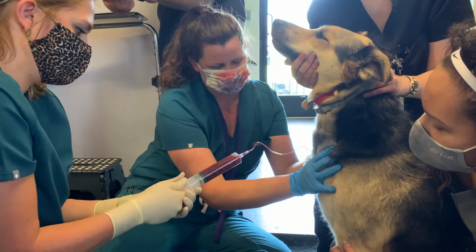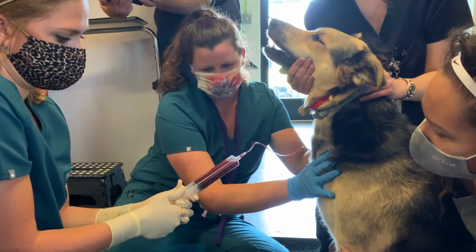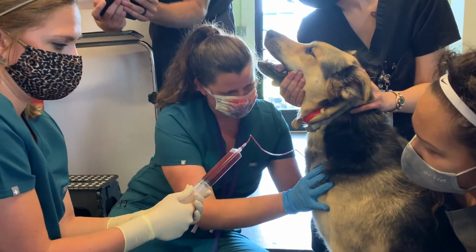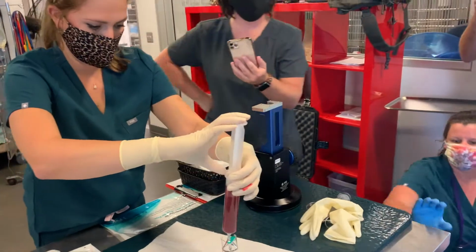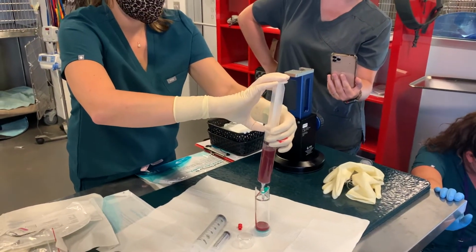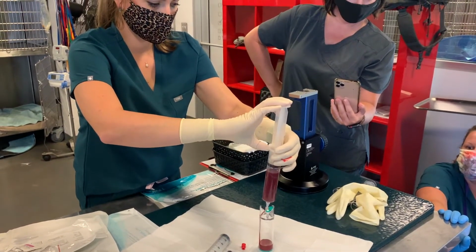We can stop at any point, and what we can do is readjust the weight of the counterbalance. So if you feel like you're done, we're good. Yeah, I think we're done. Pour it down the sides if you get it all the way in there. It's just meant to keep it from splattering or getting foamy. Okay. So slowly push on this one. Yeah, that's good.